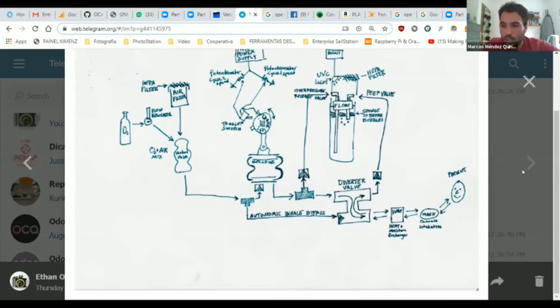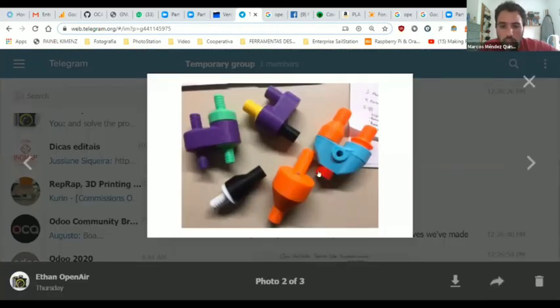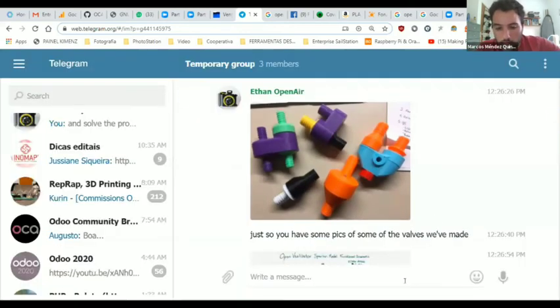And here I can show you the prototypes we made with 3D printing, but we can also use the valves that are in these tubings. So the check valves inside. And the diverter valve we are also trying to adapt to PVC tubing pipes. Thank you.